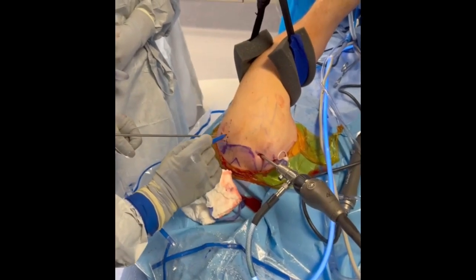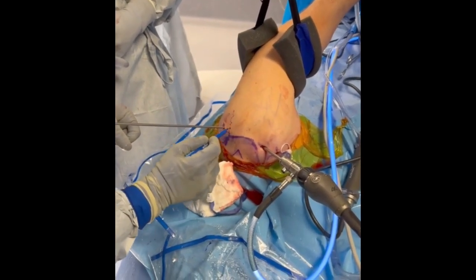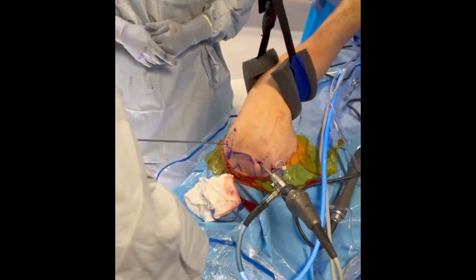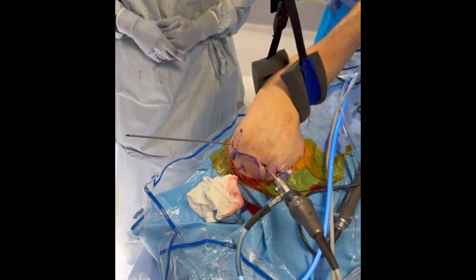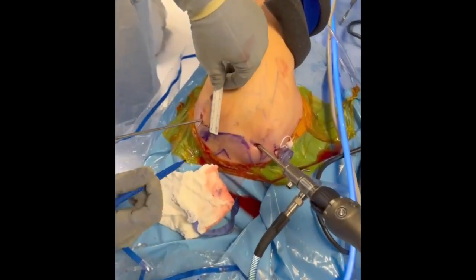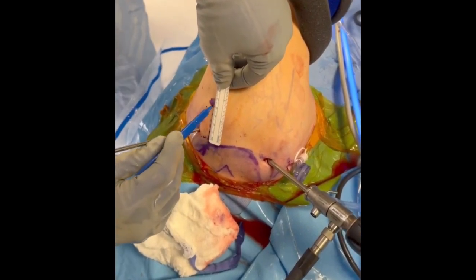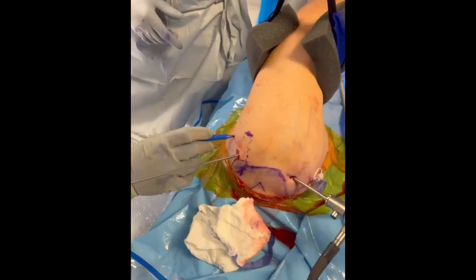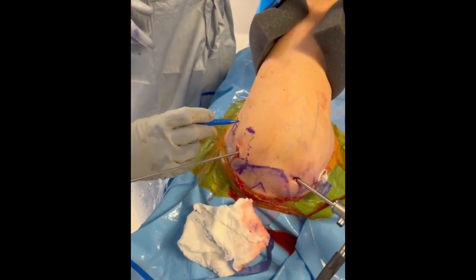Following a diagnostic arthroscopy and preparation of the glenoid and labrum for repair, the arthroscope is switched to the antero-superior portal and attention is turned to establishing the percutaneous posterolateral portal. This portal is typically about 4 cm directly lateral from the posterolateral border of the acromion and is often in line with or inferior to the posterior portal.